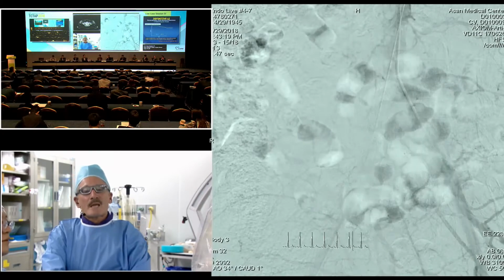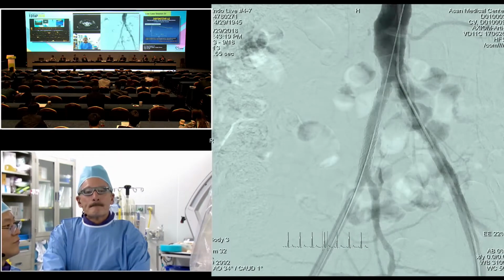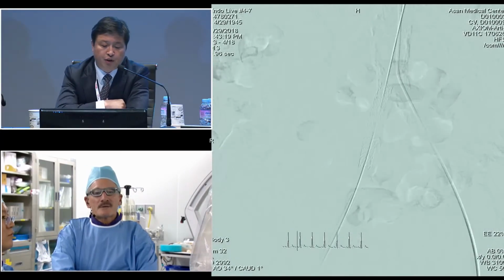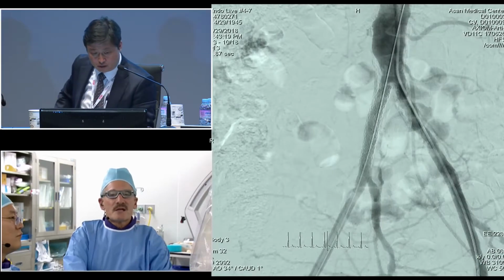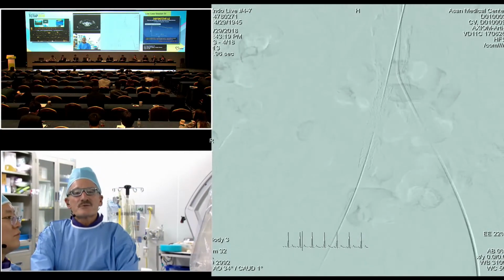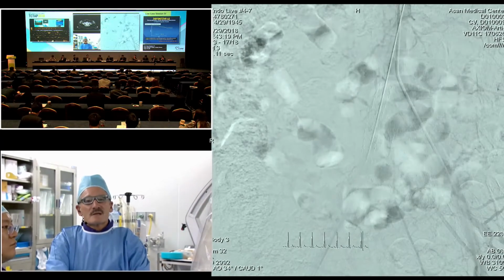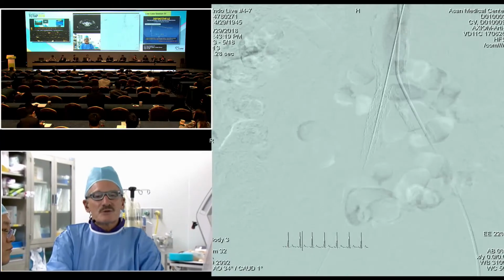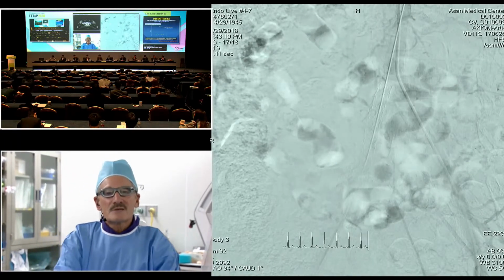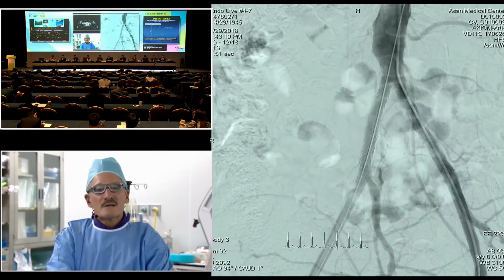Do you see some differences between the LifeStream and the VBX stent graft? They use very similar platforms. Any profile difference? Right. There are now 3: the iCast, the VBX, and the LifeStream. Of the 3, interestingly, the LifeStream and the VBX are the 2 that have iliac indication in the United States. The iCast has been around forever, but never did the prospective iliac trial to gain indication.